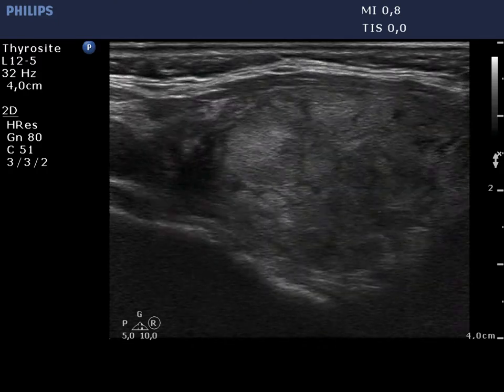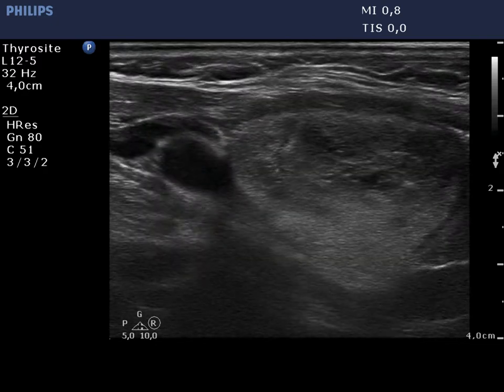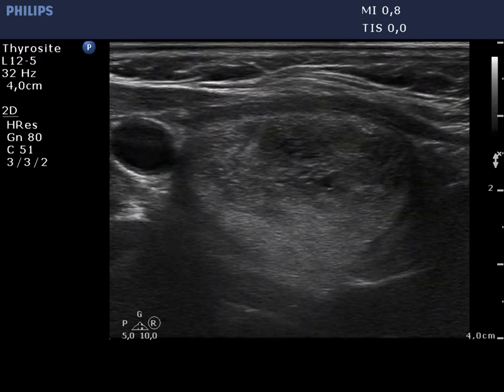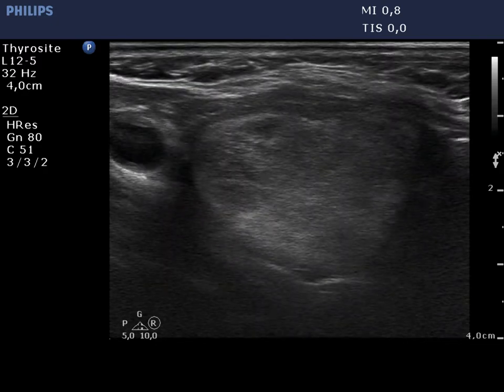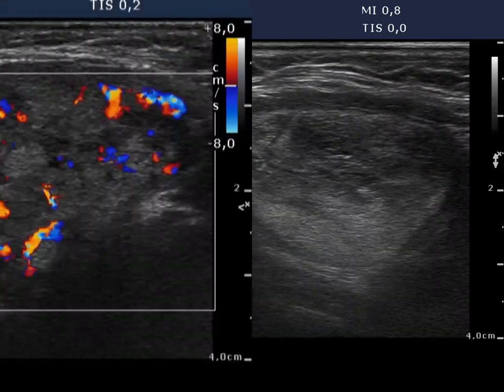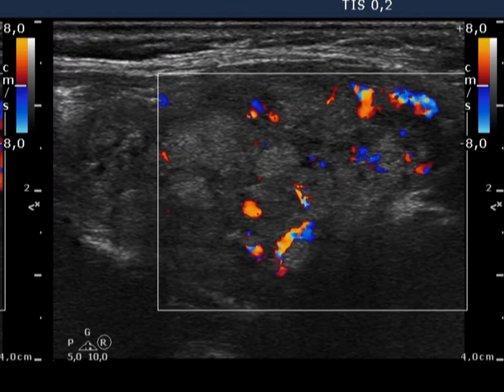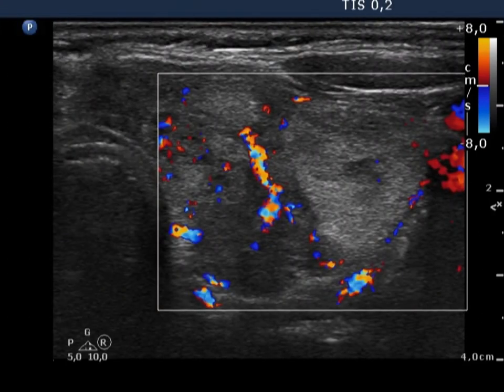Note intranodular fibrosis. Perilesional blood flow is demonstrated, while there is no vascularization within the nodule.